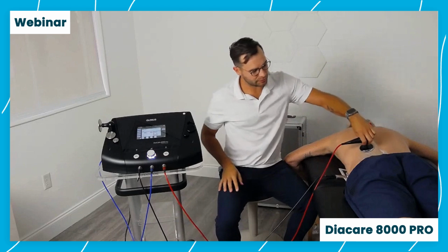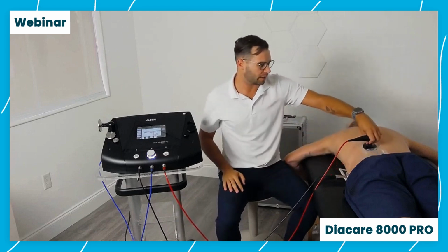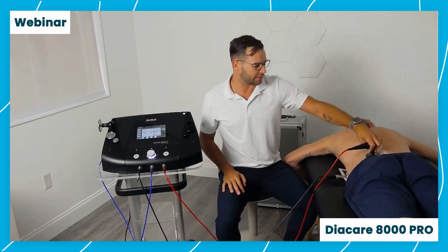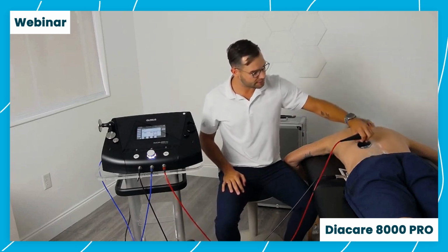So by now the patient would be feeling a local heat all over wherever you're moving that electrode. So as we move it across the back, as we move it down towards the pelvis and towards the glutes, he's going to feel it directly where the head of the electrode is.